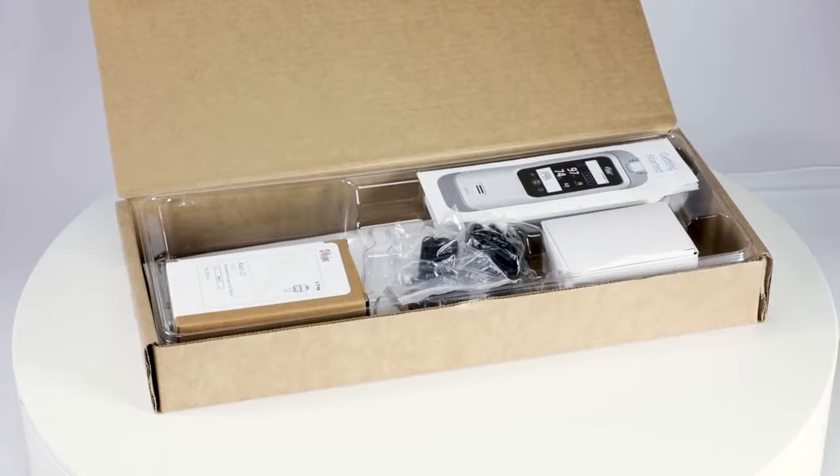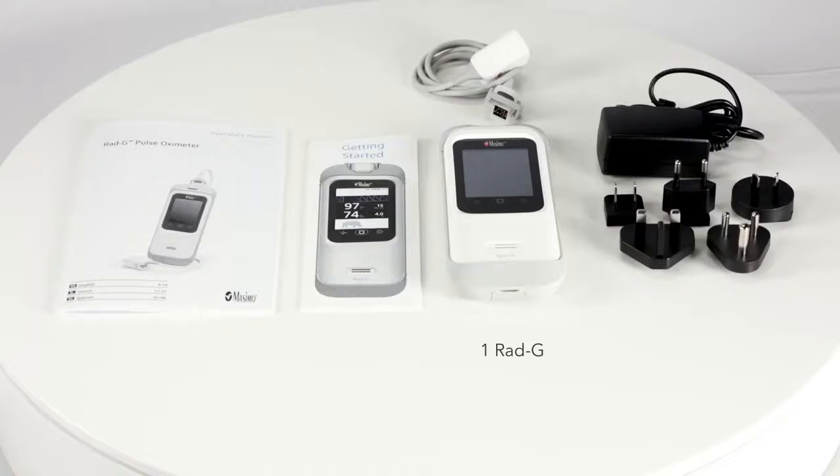In the RadG box you will find the RadG device, one RadG sensor, one charging cable, plug adapters, and a quick reference guide that walks you through the basic operations and setup of the device.